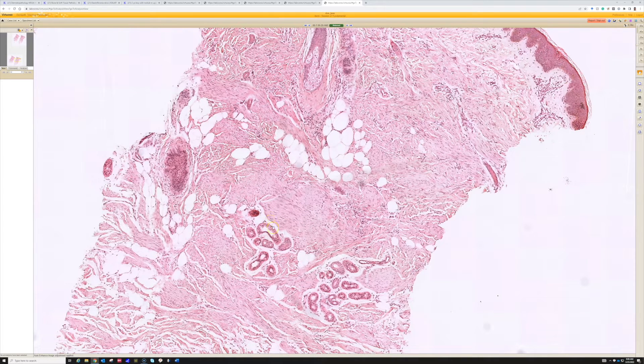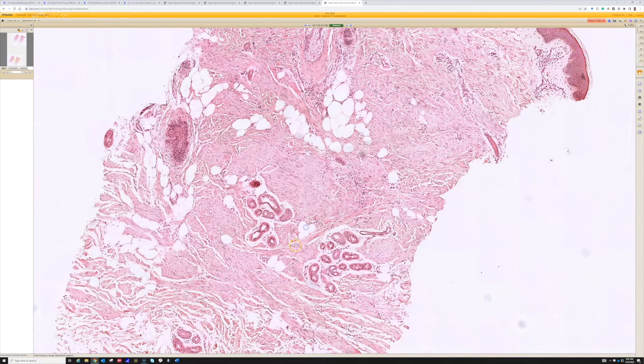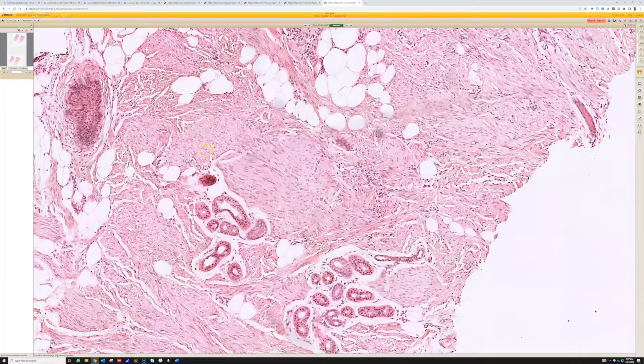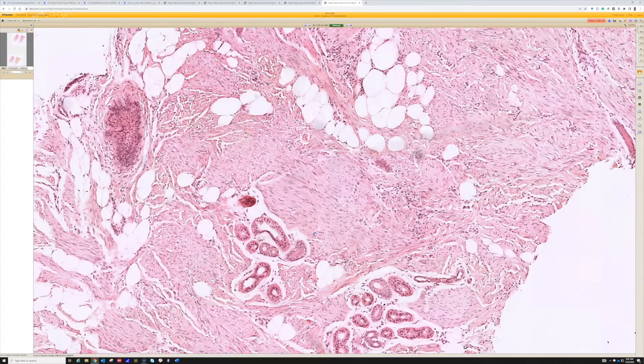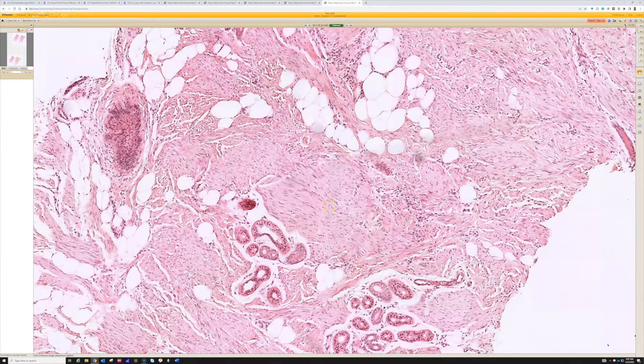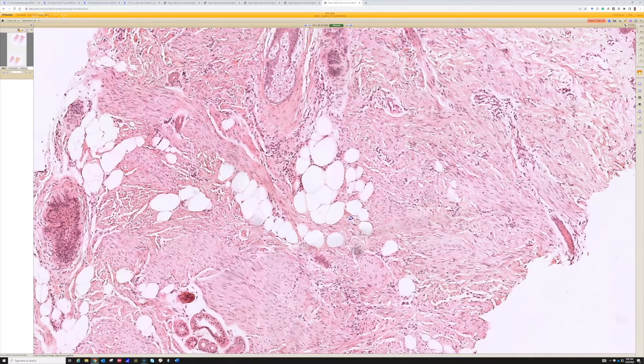So I've not seen before, and maybe I'll be proven wrong one day, but so far, to my recollection, I've not seen this pattern of such discrete fascicles of bland hypocellular spindle cells. I don't recall ever seeing that in a DFSP before.